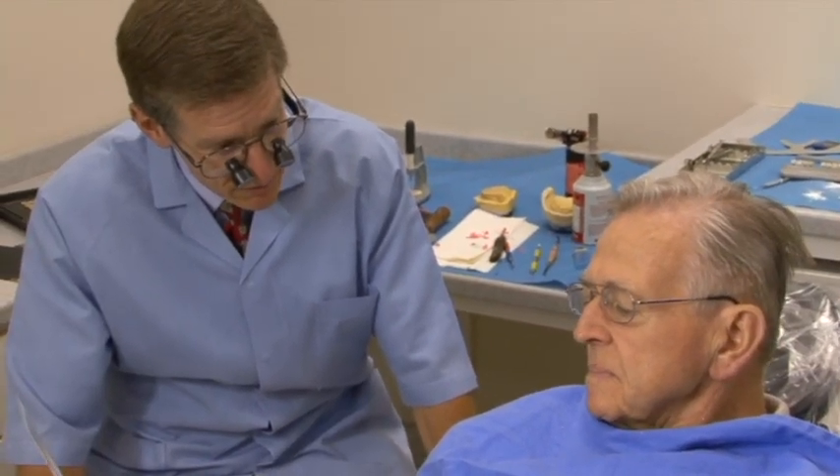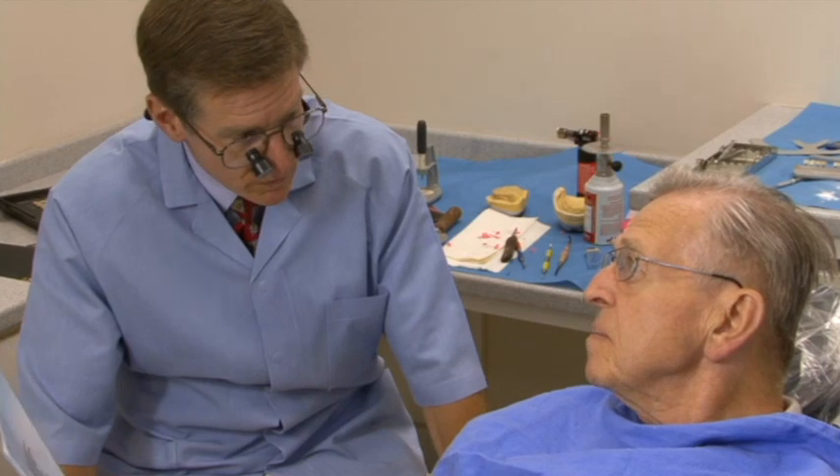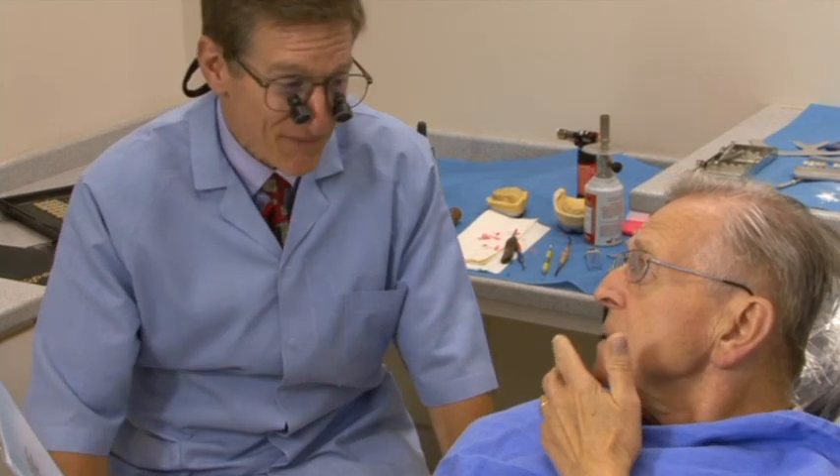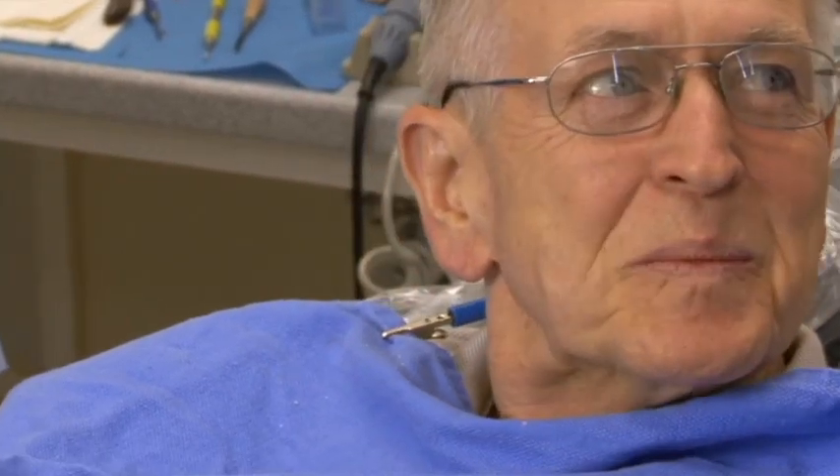Did you feel like you were struggling at all with that? No. That's the wax try-in — those aren't yours. He said, I hope you got that picture when he laughed. You can see that he's got really good lip support, and I think that comes back to that wax rim and getting the necks of the teeth right. What was great to hear him say — he thought that was his denture. And it's actually the wax try-in that we're doing. We even changed the teeth out; we didn't use the same teeth that we used in your denture.